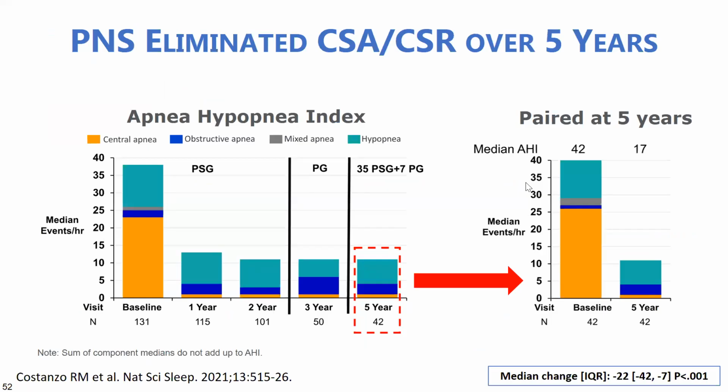What we find here is that over a course of 5 years, the AHI goes down dramatically from rather high levels in the high 30s down to roughly 10 episodes per hour. Very comparable, if you will, to the INSPIRE results for hypoglossal stimulation in OSA patients. But you can also drill down to these data, and you can see that the phrenic nerve pacing system, the remedē system, is effective particularly in taking care of or getting rid of, if you will, the central apneic episodes, with the remaining obstructive apneas sort of persisting as a background level.